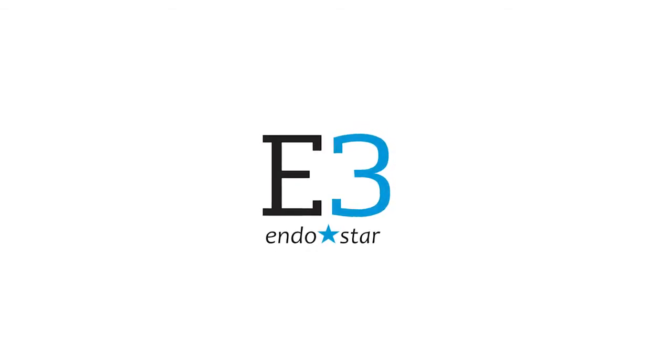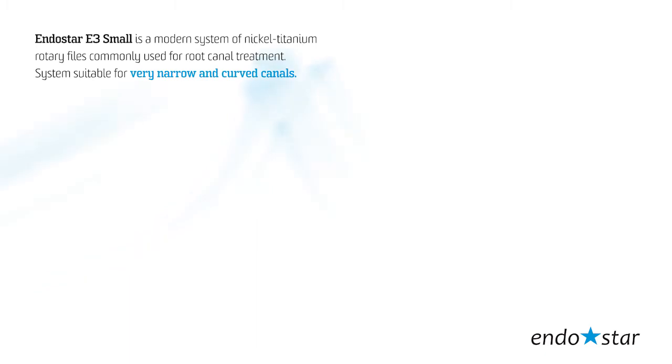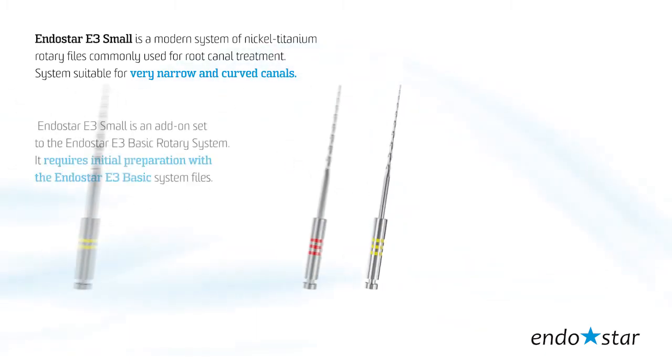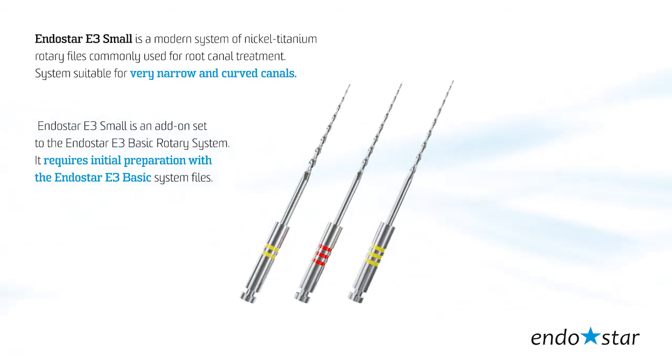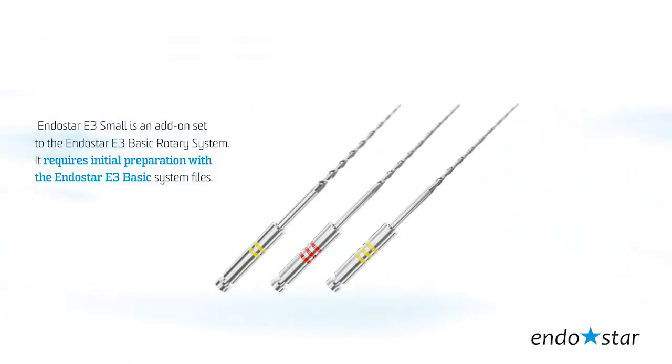The Endostar E3 Small is a modern system of nickel-titanium rotary files commonly used for root canal treatments. The system is suitable for very narrow and curved canals. The Endostar E3 Small is an add-on set to the Endostar E3 Basic rotary system.